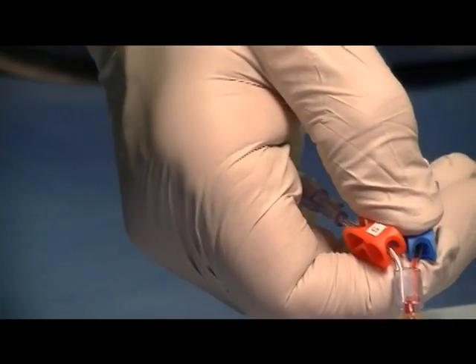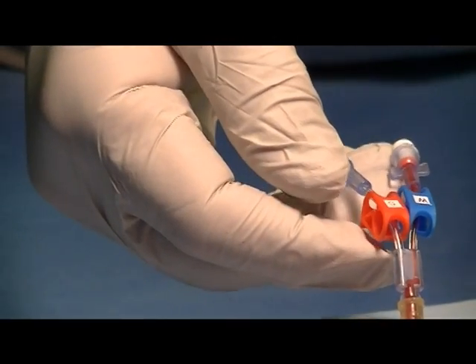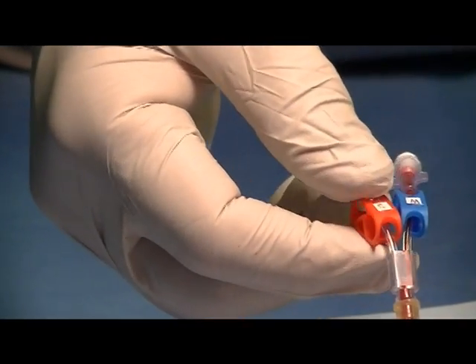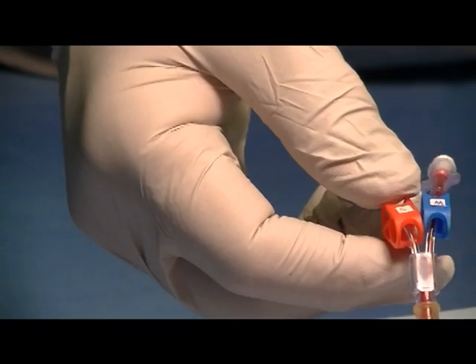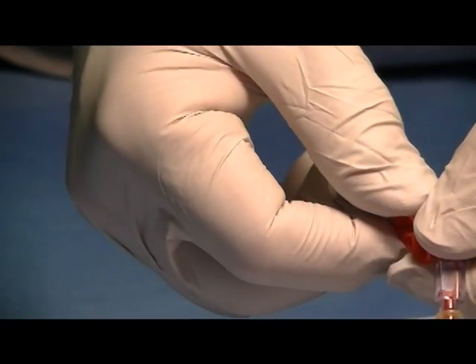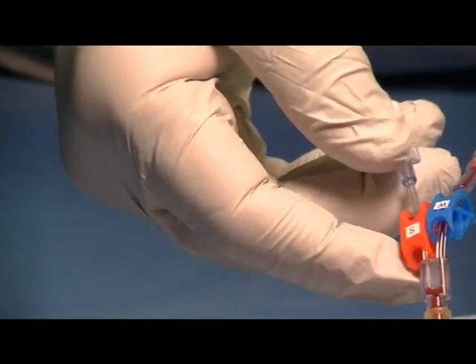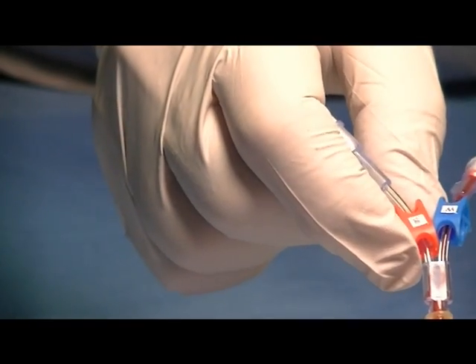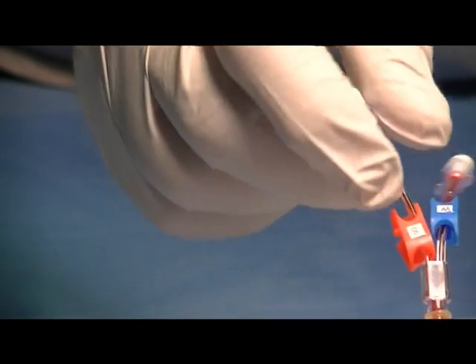Then you would reclamp that line and go to the sample side, release the red clamp and allow the blood to flow up to the vent plug.